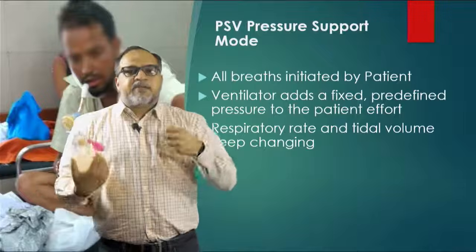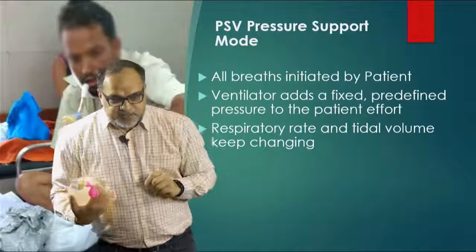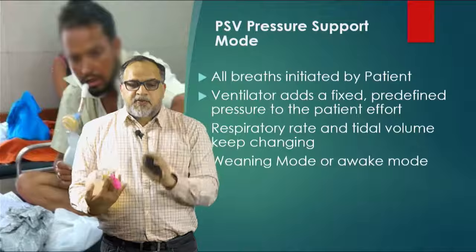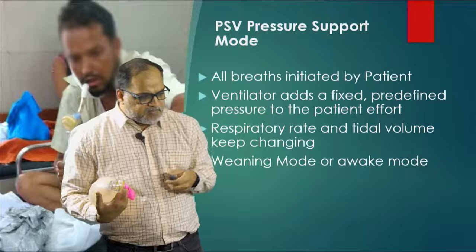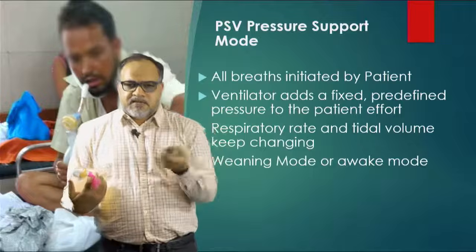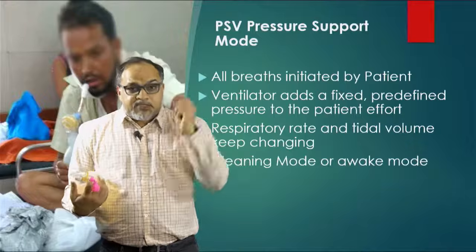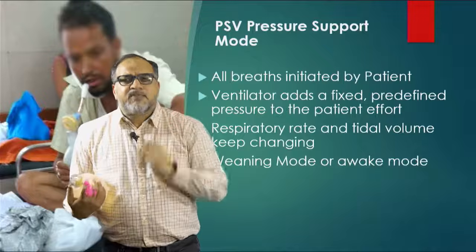A, how much effort the patient is generating, plus the 15 centimeters of ventilator-given breath. So you cannot decide what will be the minute volume or anything. But this is a very good mode if your patient is awake, if your patient is in weaning. If your patient is awake, if your patient is in a weaning mode, pressure support mode is one of the best modes. In fact, I would say if your patient is struggling with the ventilator, just put him on PSV and watch. Just watch what exactly he wants.